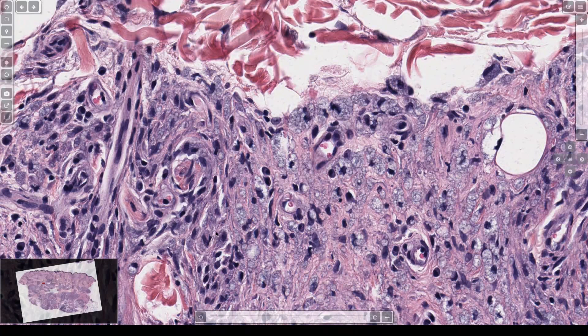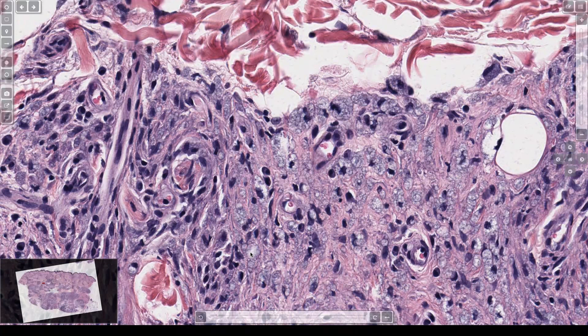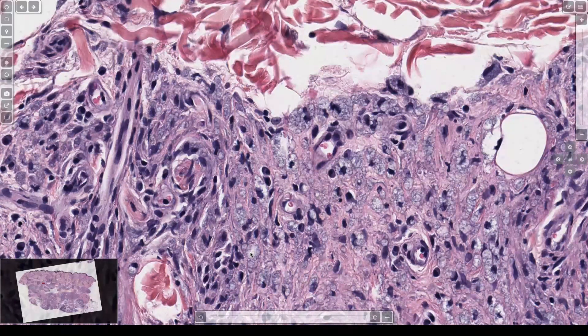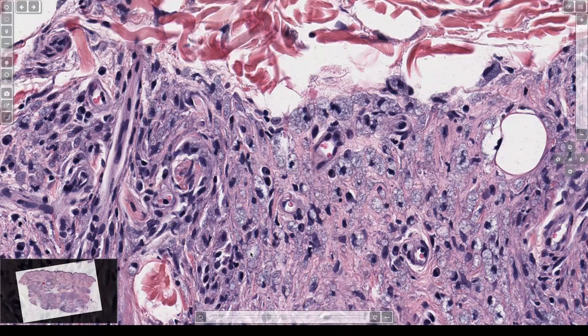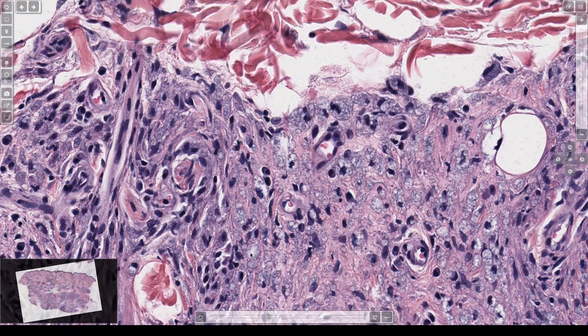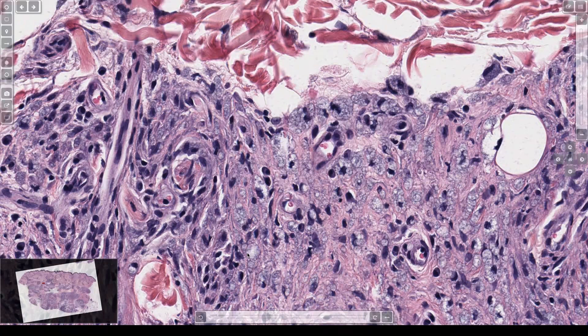Each of these spaces is called a globus, and they're filled with thousands and thousands of organisms. You can usually see them on H&E — it's hard on scan because they're so small, but you can see this fuzzy material in the spaces and learn to pick up leprosy that way.